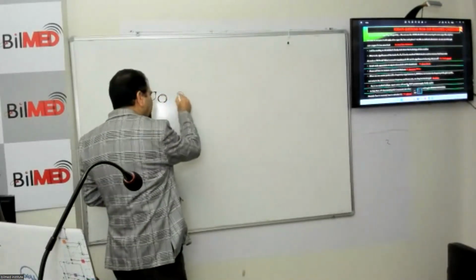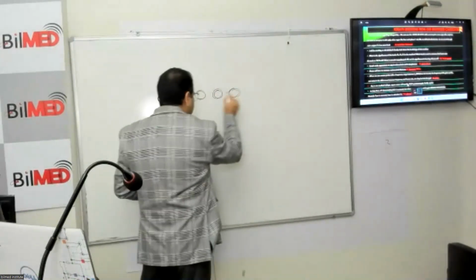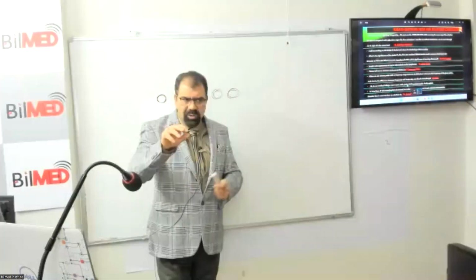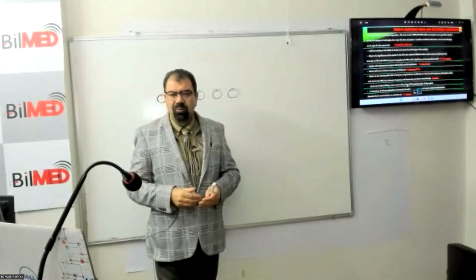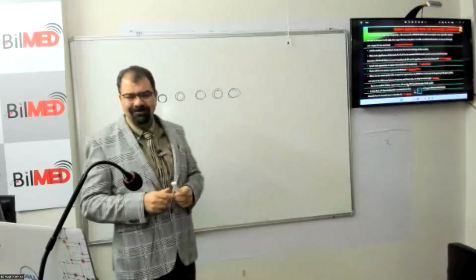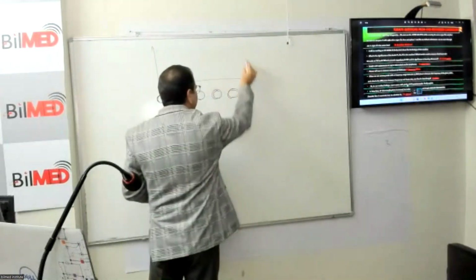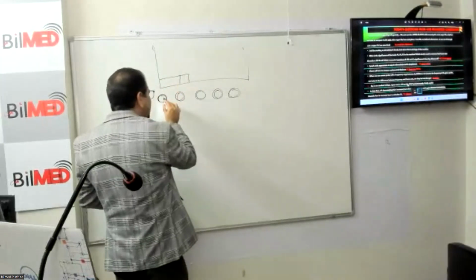The multifunctional knobs. You know, where are these multifunctional knobs? These multifunctional knobs are on the top of your machine. But why am I using the word multifunctional knobs? Because it is not written that this is for frequency. The monitor will tell you. Now see, the monitor is here. For example, the monitor will show you a display against this knob.